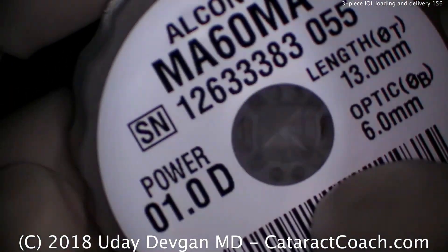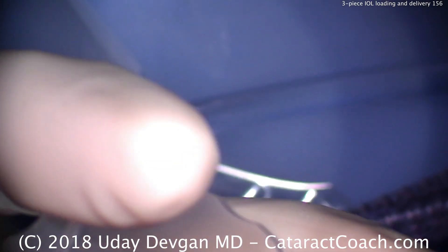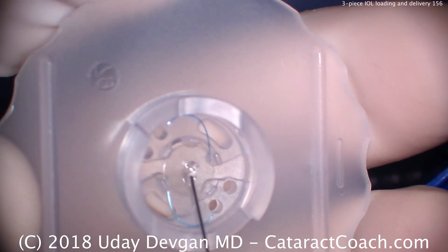It's CataractCoach.com and today we're talking about loading a three-piece lens. There it is — an Alcon MA60 series in a power of 1.0 for a very large, very myopic eye with a long axial length.